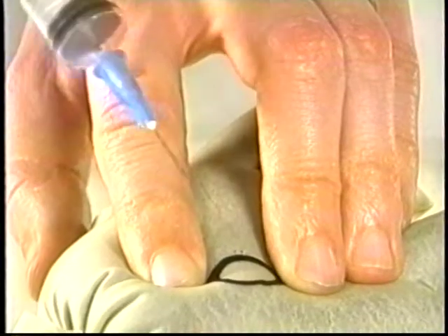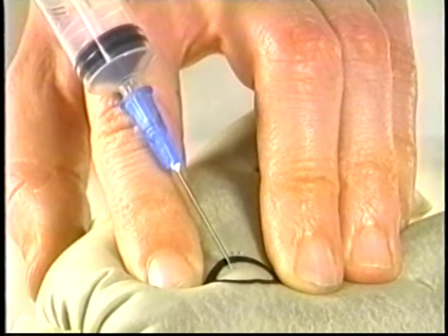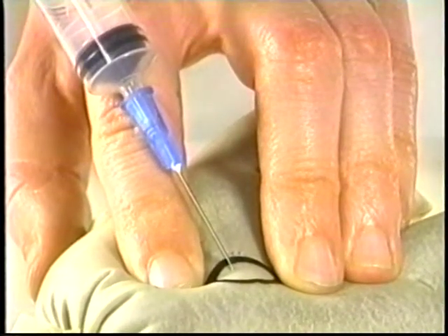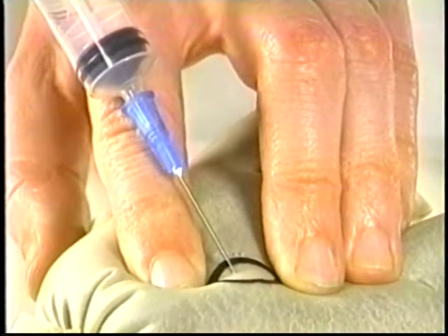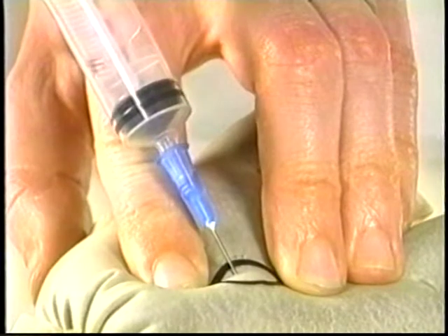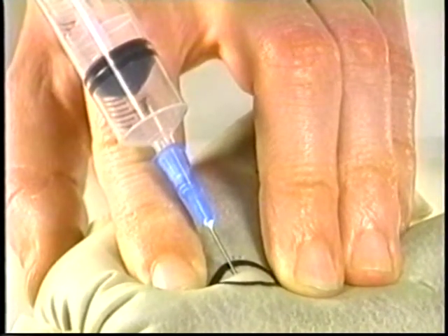I lean the syringe on my fingers for support. This allows me to position the needle tip just above the surface, ready to penetrate at the pre-planned spot. The needle is advanced into the target and the plunger is retracted to create suction.